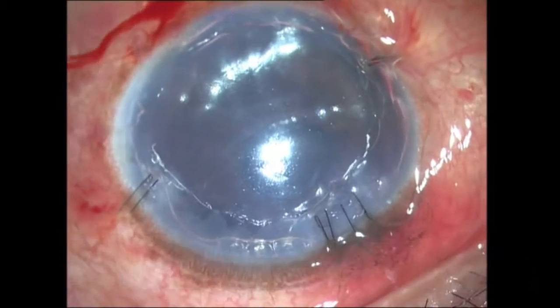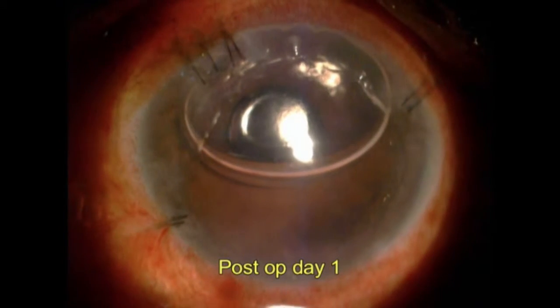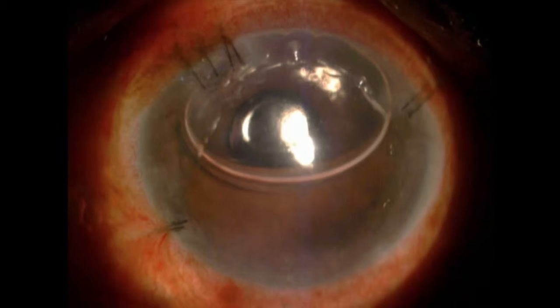So you can see that though I started out like that, now it's a beautifully centered graft. This is a post-operative first day appearance, very clear. Of course, you need to make sure that you don't handle the graft too much. Your touch when you're doing the air pump assisted technique should be only in the periphery of the graft, as minimal touch as possible.